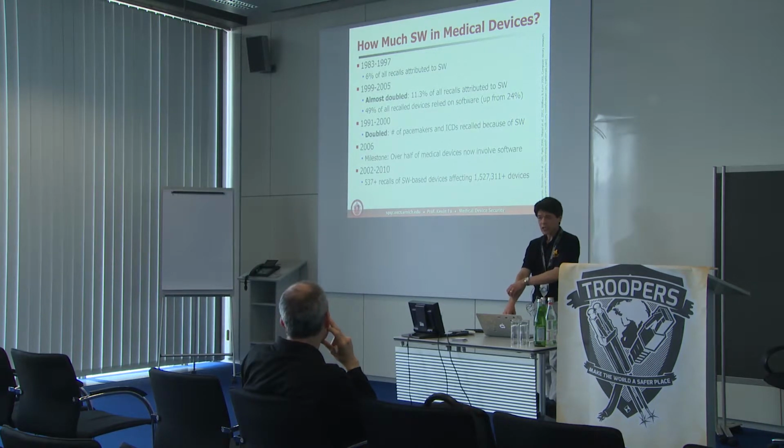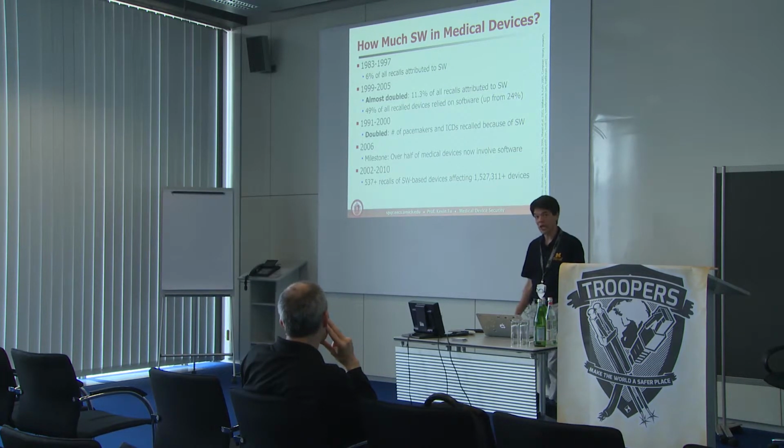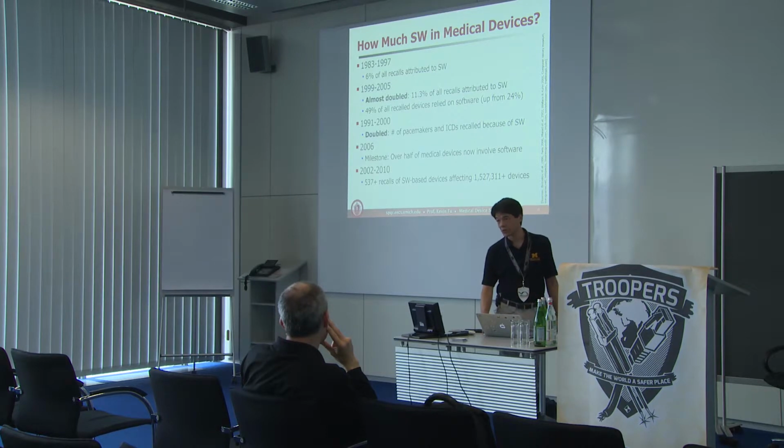And to give you an idea of just how software affects recalls, at least in the United States, there were over 537 recalls because of software-related issues. And this affected about 1.5 million different devices on the market.